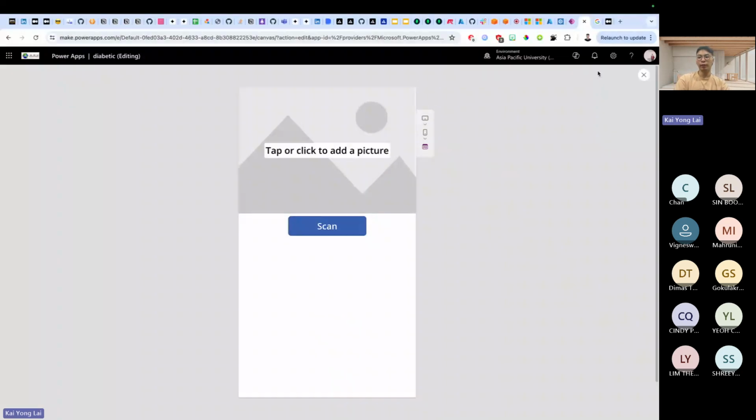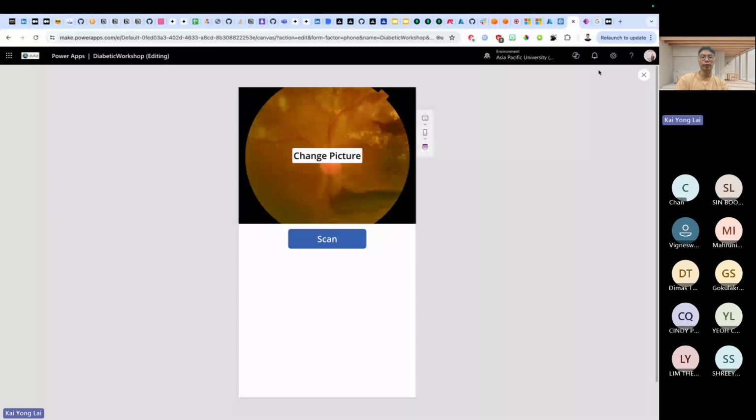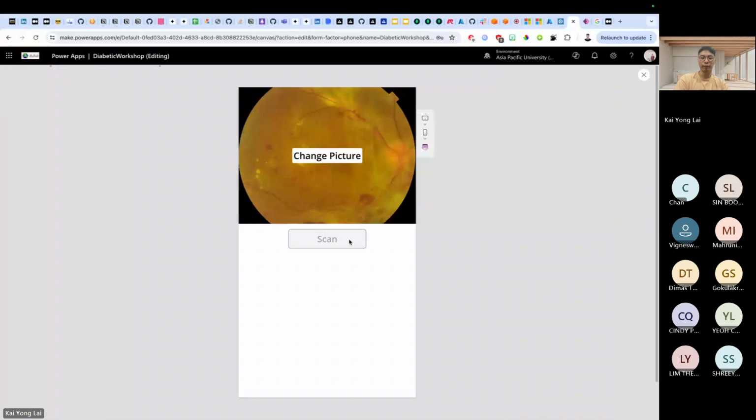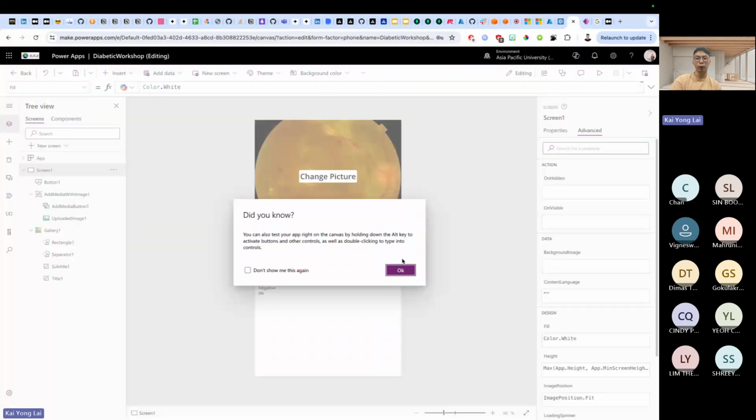Okay, so you can run, oh, this is the previous one. Okay, so you can run this. Just now we already placed the image. Of course, if you want to change it, you can change it accordingly. Then you click on the scan. And voila, you see? Now we have our integrations ready. We can see the values of the predictions directly on our application. If you want to publish it, that works as well.